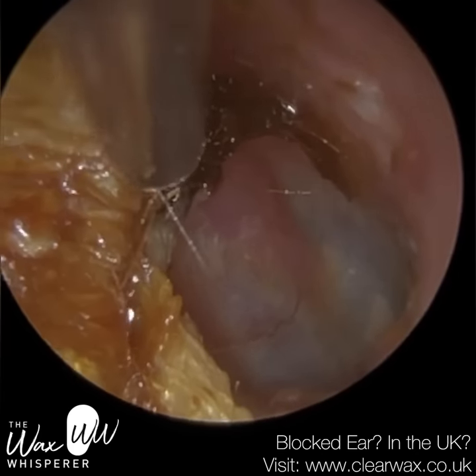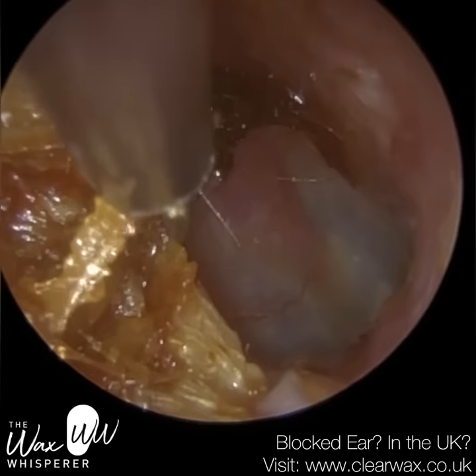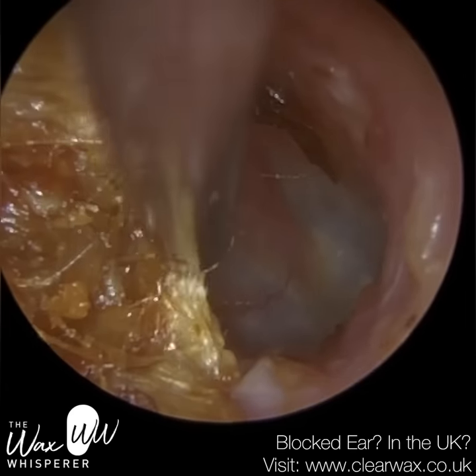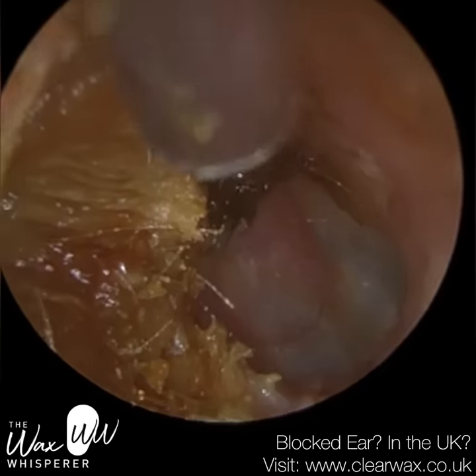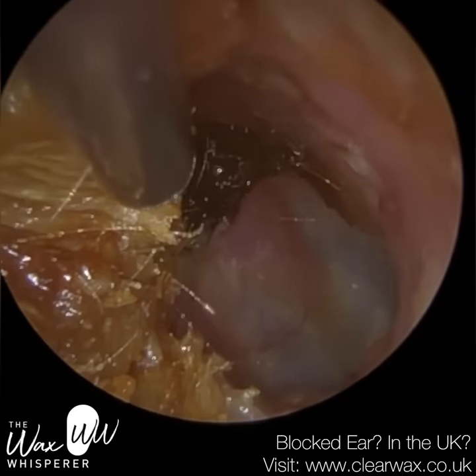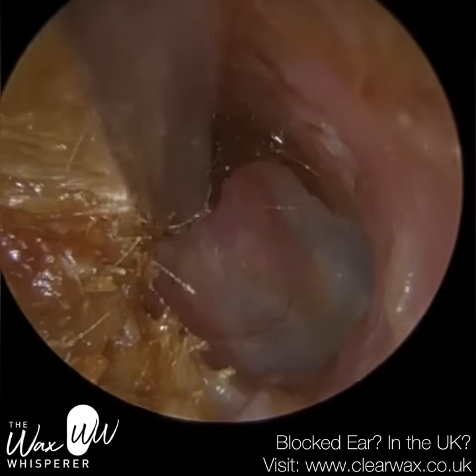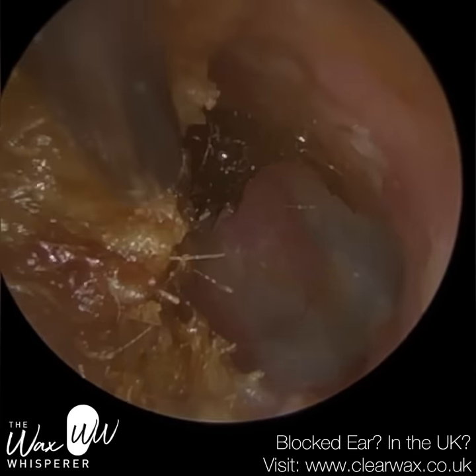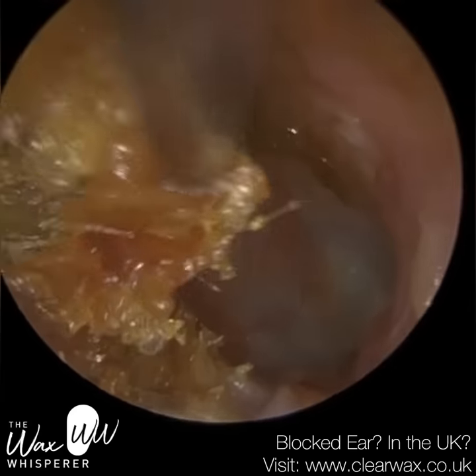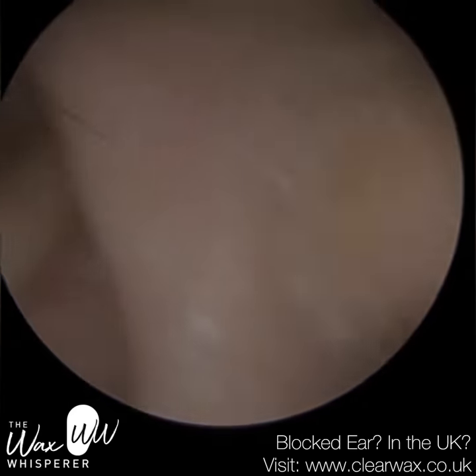So I'm now just going to peel some away. The skin, as you can see, has this ribbon texture. The eardrum is more or less visible. There is still a bit of wax, but not on the eardrum itself — it's just on the roof of the ear canal adjacent to the eardrum, but we're going to try and remove that as well. I think I managed to do so, if memory serves me right. With this dead skin, I'm just using a rocking motion to slowly peel it away at the canal wall.